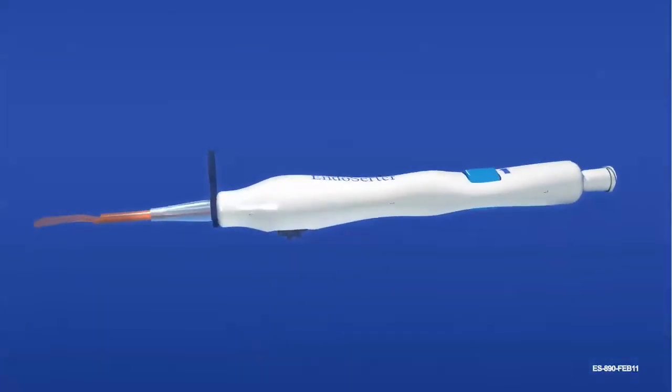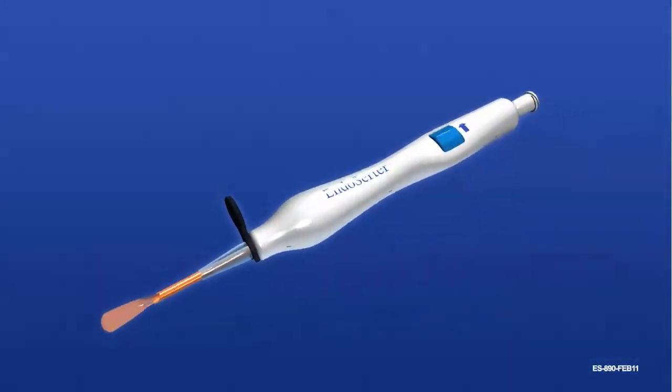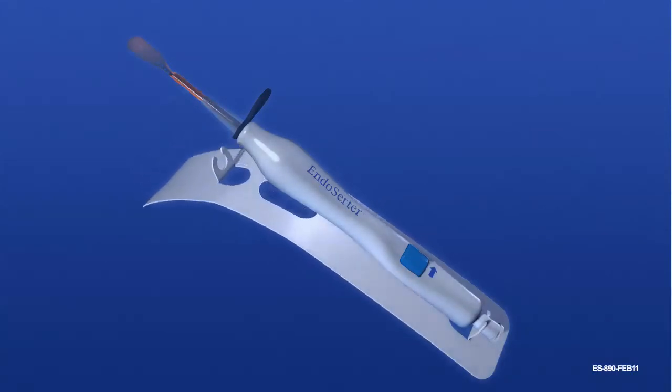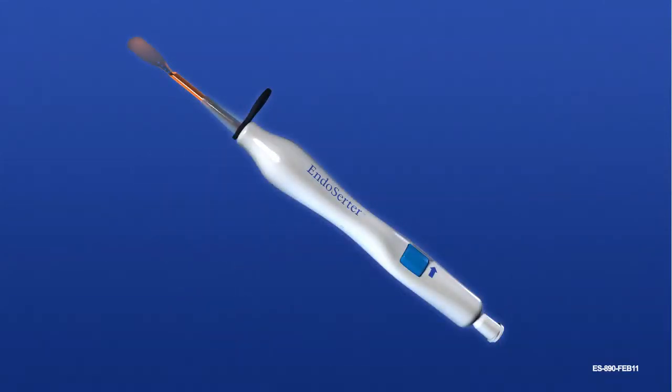Open the package and handle the device using standard sterile procedures. Hold the device by the body and remove the white plastic platform card by gently pulling it down and away from the carrier end of the device.